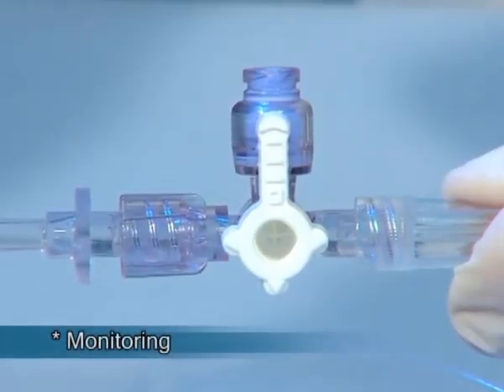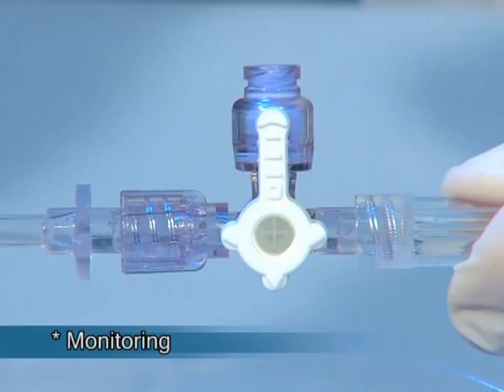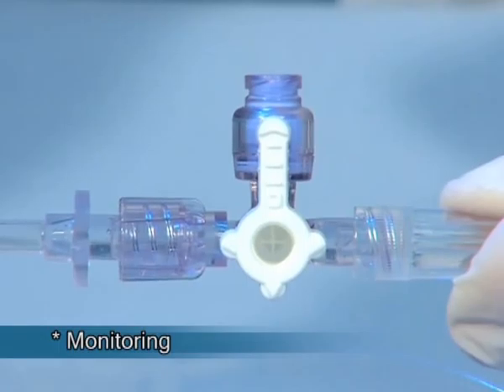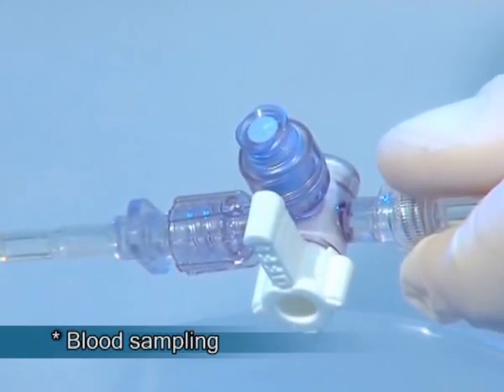Monitoring can be done using the Marvelous without any risk of signal damping. This is achieved by the Marvelous innovative design that assures complete separation between the flow path and the valve when the handle is switched to the monitoring position.